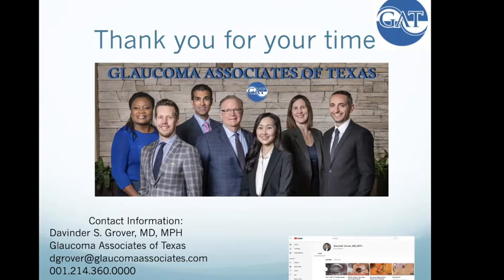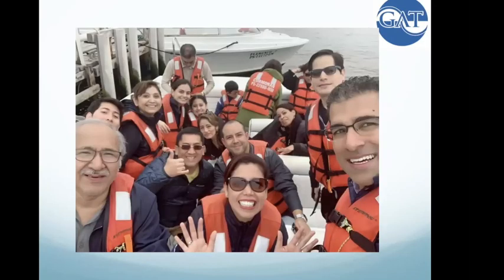Are you able to answer some questions? Of course. There's a question that said, in your experience now, do you prefer a partial trabeculotomy or do you still prefer a 360? Because you can do a partial only in the nasal quadrant, and you have almost the most amount of collectors there.